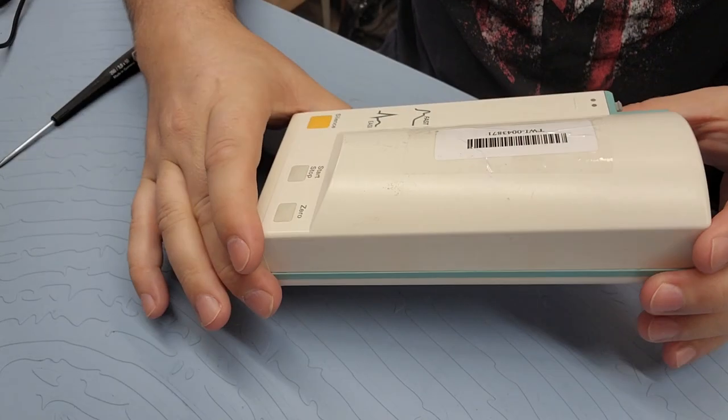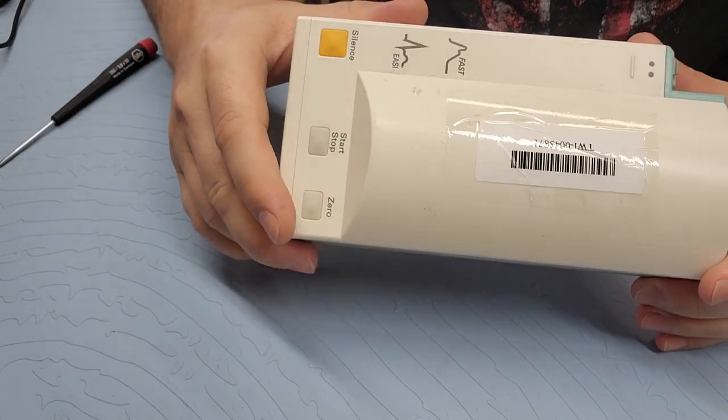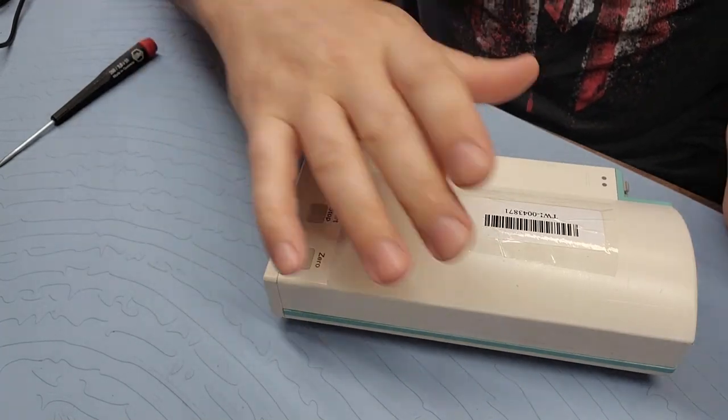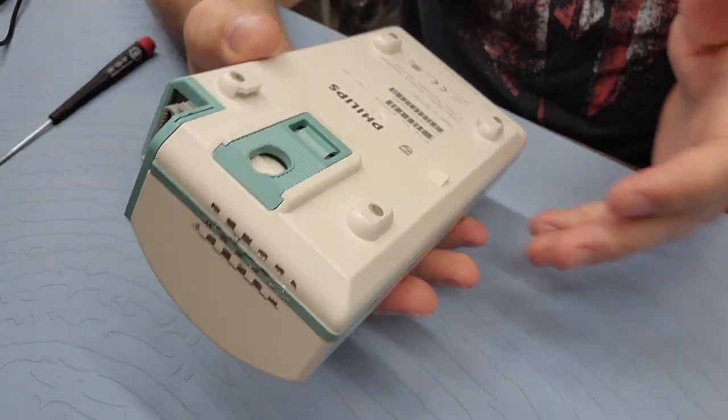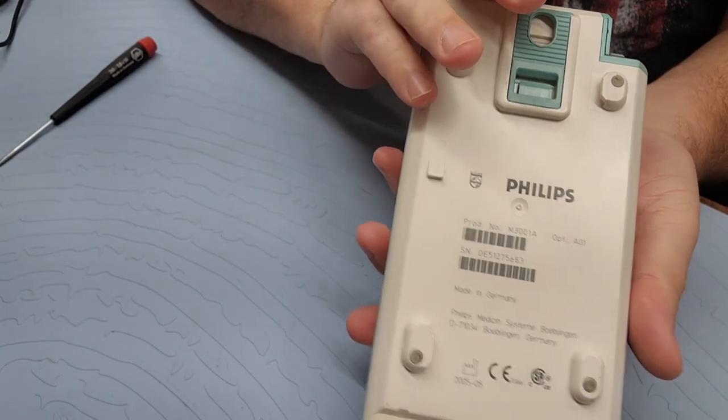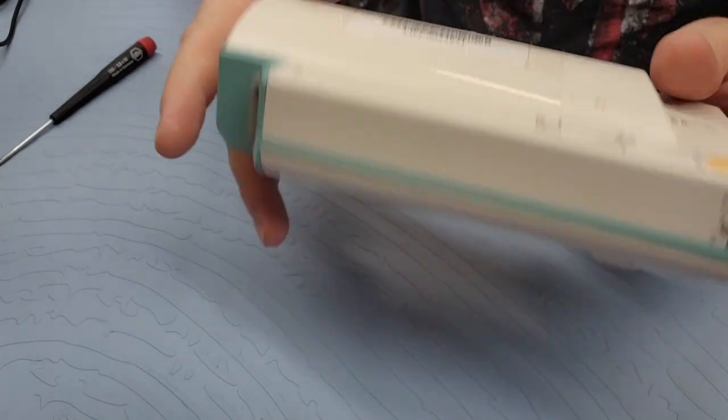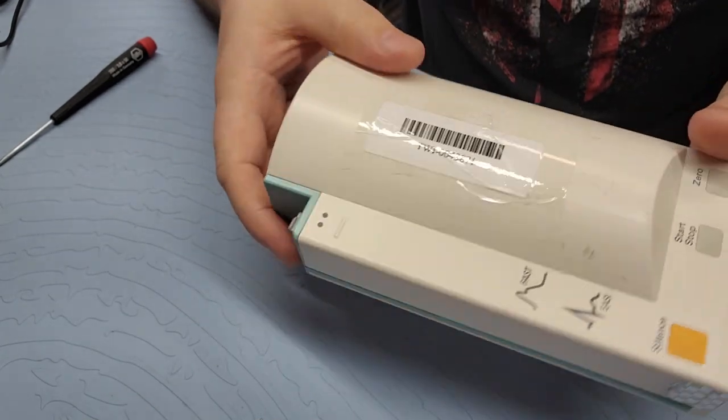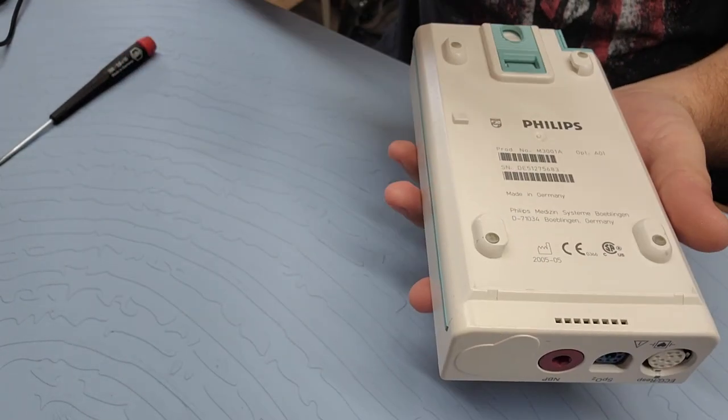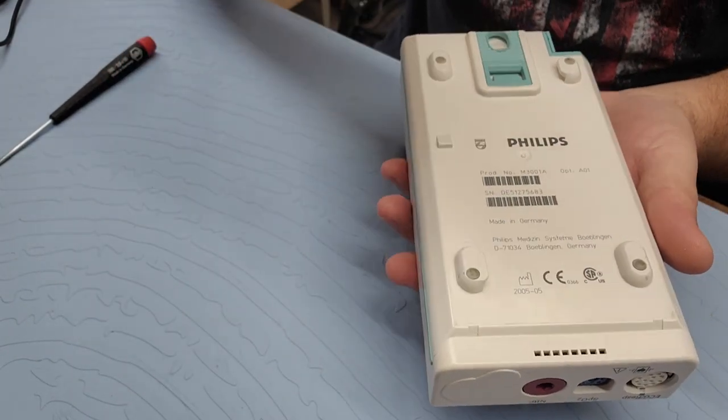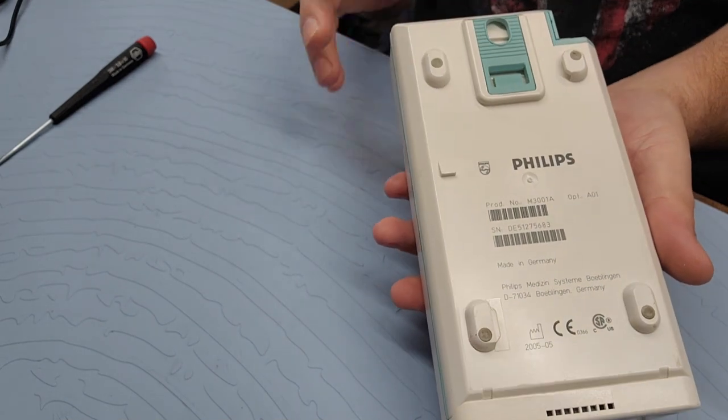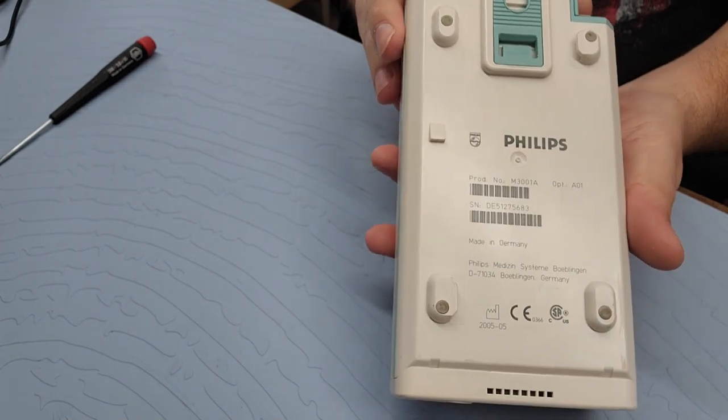Hey everyone, welcome back to Better Biomed. Today I have one of my donated items from Relink Medical. This is going to be a teardown and explanation of the Philips M3001 Alpha.